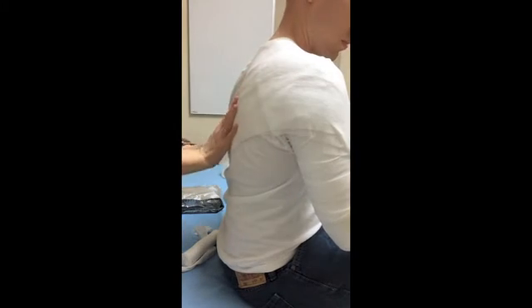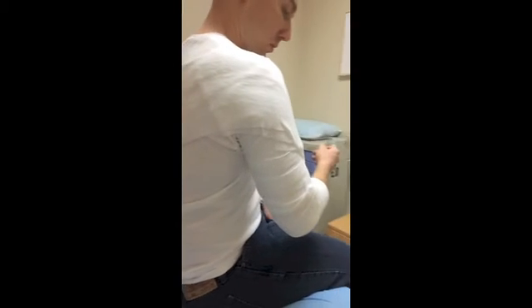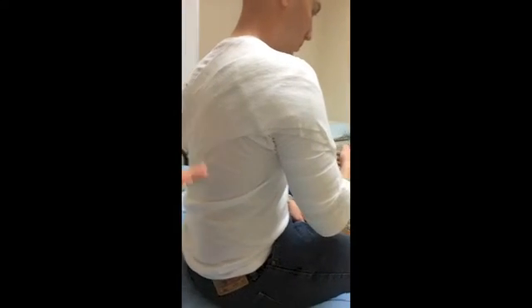Okay, so we've smoothed most of the wrinkles. Our padding came back from here to down low here, so we've got plenty of padding over the scapula. Our splint is cut, so now we can go ahead and start our application.